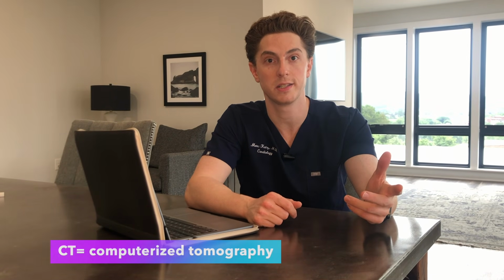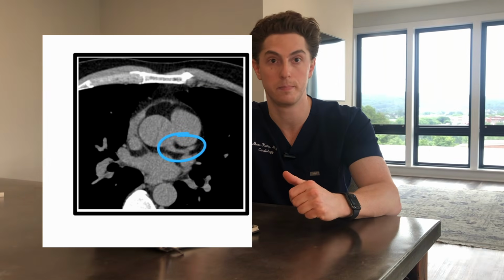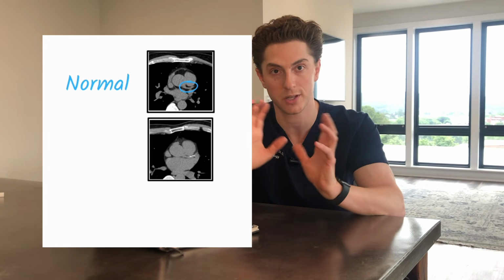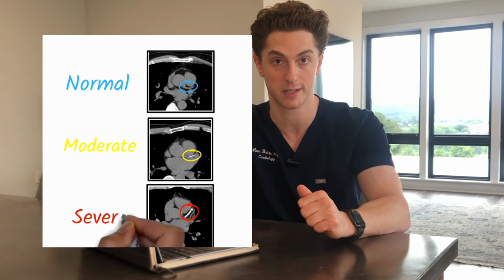At the most basic level, a coronary artery calcium score is a CT scan of the chest that specifically looks at the arteries of the heart, and specifically the degree of calcification. The basics of the test involves going into a CT scanner, or computerized tomography scanner. We gate that image, or we sync it up with the patient's EKG. So when we take multiple slices of images of the heart, we can sync them up to make that moving image look 2D, or two-dimensional. A computerized system counts up how much calcium based on the pixel count a patient's arteries have, and it gives us a total score as well as individual scores for each coronary artery, or the arteries that supply the heart itself. But why is that important?